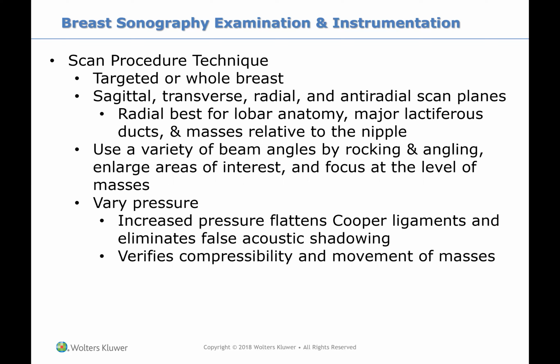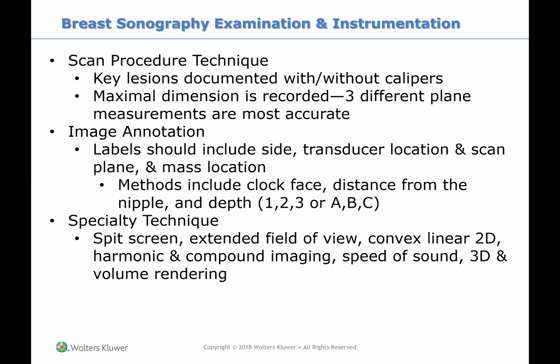Increased pressure flattens the Cooper ligaments and eliminates false acoustic shadowing. So you want to make sure that you're putting some pressure, not too much, but some pressure to get rid of the acoustic shadowing and something that could potentially look like a mass. Key lesions are documented with or without calipers. The maximal dimension is recorded. You do a 3 different plane measurement too.